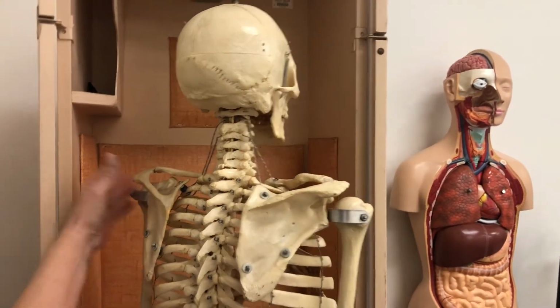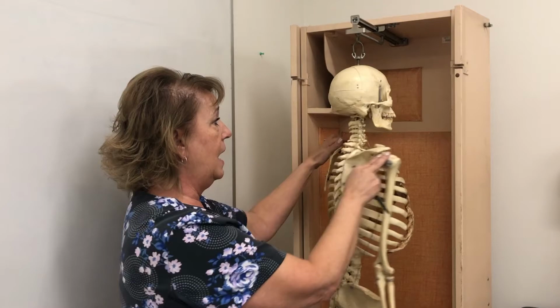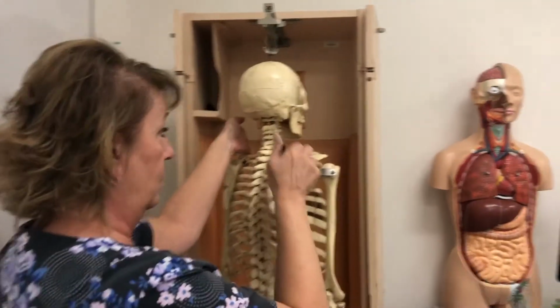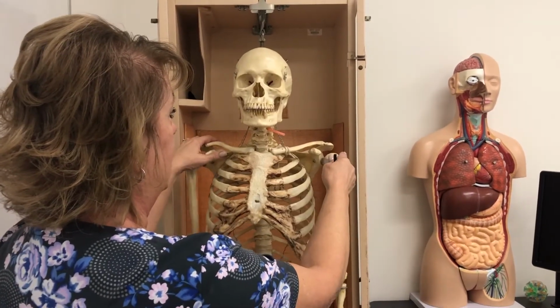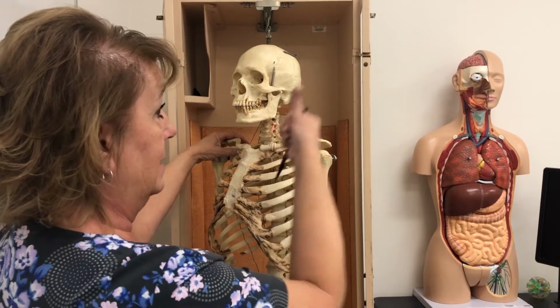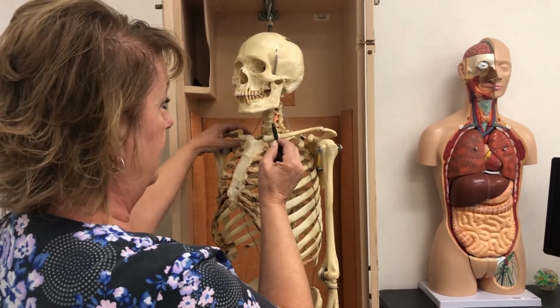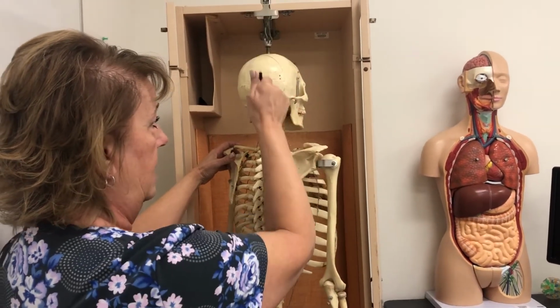So what we're trying to do is position the patient and the central ray to open up how the intervertebral foramina are positioned. So when they're PA oblique, you're looking at the foramina that's down, and I'm angling caudad. When I'm doing AP obliques, I'm looking at the foramina that's side up, and I'm angling up. Okay, side up, angle up, side down, angle down.